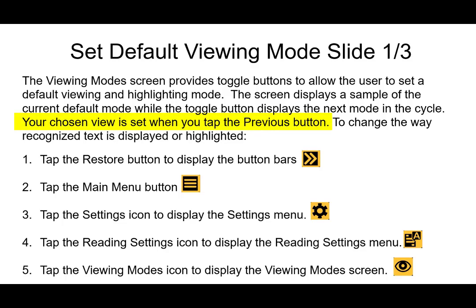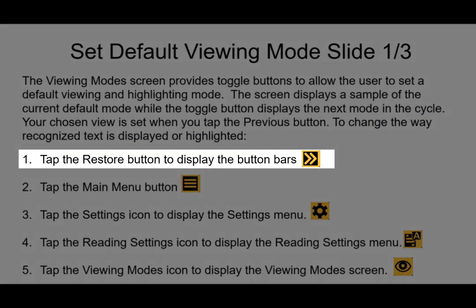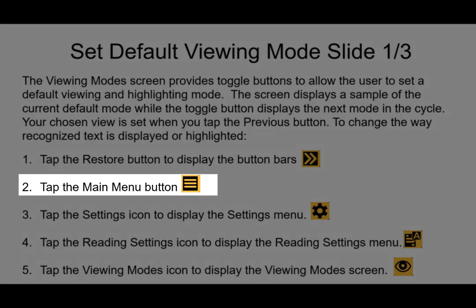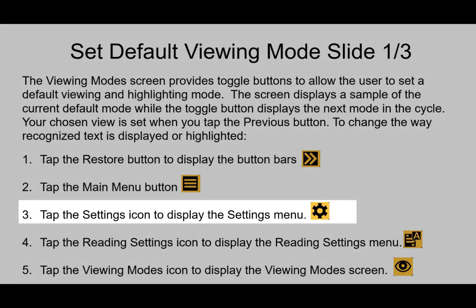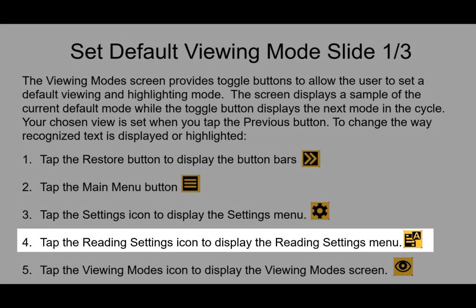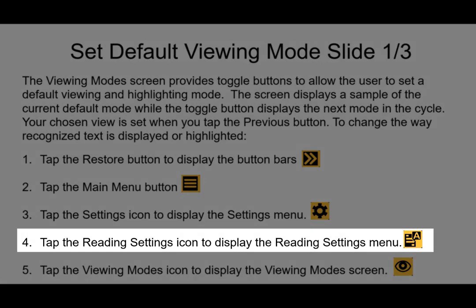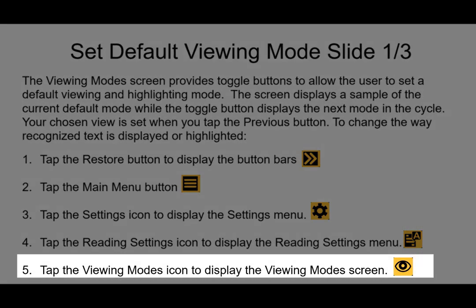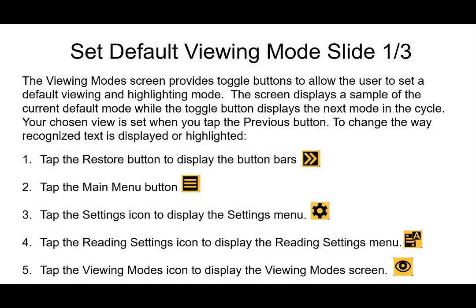To change the way recognized text is displayed or highlighted, tap the restore button in the bottom left-hand corner, then tap the main menu button in the top left. Within the main menu, tap the settings icon, then tap the reading settings icon to display the reading settings menu. From there, tap the viewing modes icon to display the viewing modes screen, and you'll be able to navigate from there.